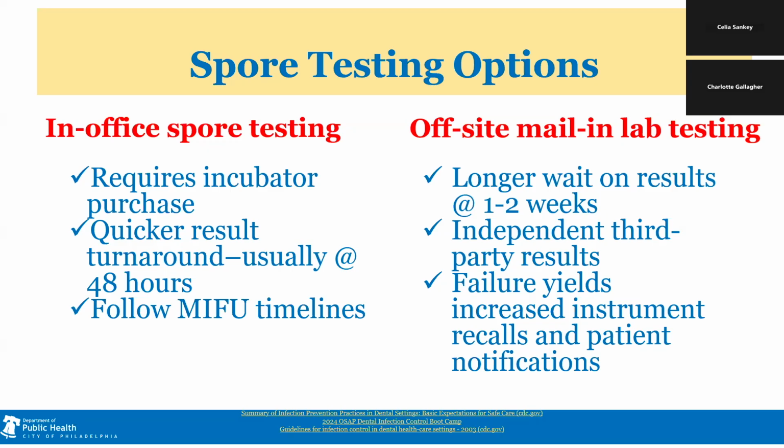But there are also off-site mail-in labs that will give unbiased third-party test results in 1 to 2 weeks. I advise you to please research these options closely prior to making choices or changes.